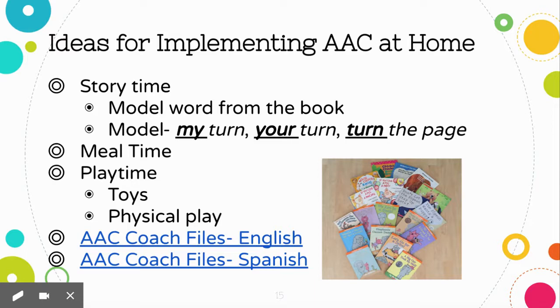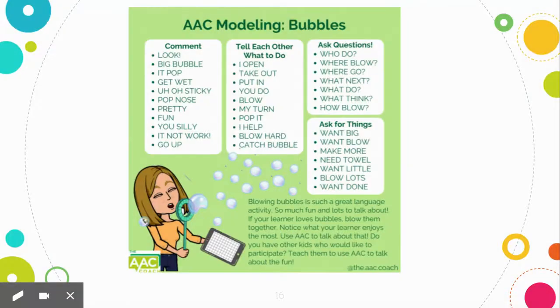I've included links here to the AAC coach files, and she's an SLP who's created visuals for different words that can be modeled in common activities that many families do. She's made these resources in English, Spanish, Dutch, Italian, and Portuguese. So here's an example of one of her files. She's broken down different ways to support language during playing with bubbles. So she has comments, commands, questions, and requesting. She has sheets like this for many common toys or activities, as well as many family routines like mealtime, bath time, and getting dressed.